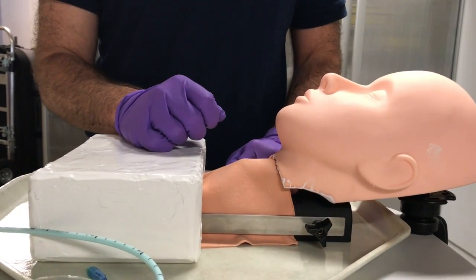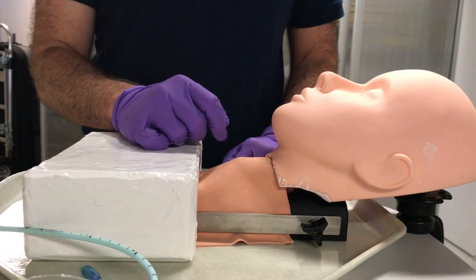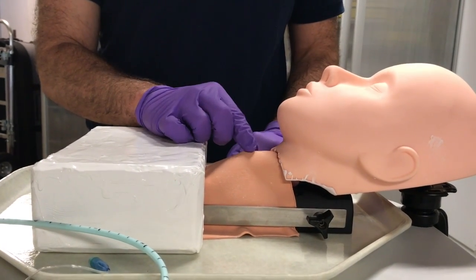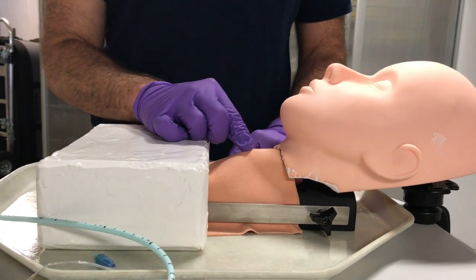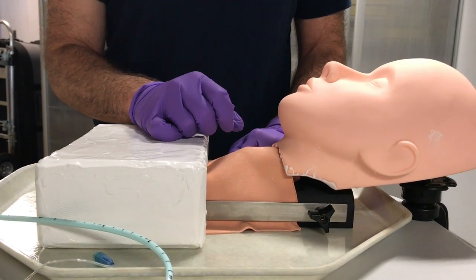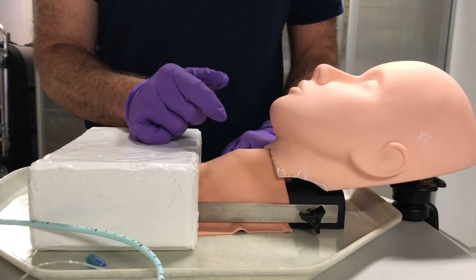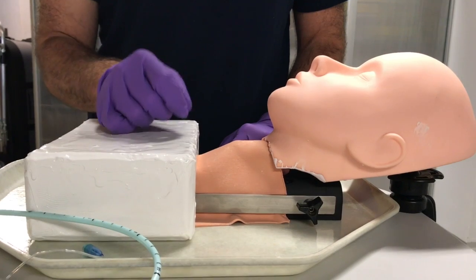The reason I do not like to start from the top is that depending on the patient's anatomy, you may feel the hyoid bone first, or you may feel the thyroid cartilage. This puts you at risk of doing an incision between the hyoid and the thyroid cartilage, and therefore doing your cric in the wrong spot.